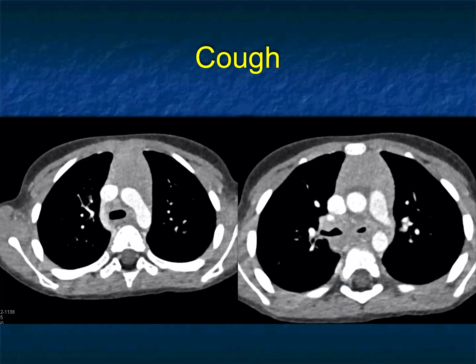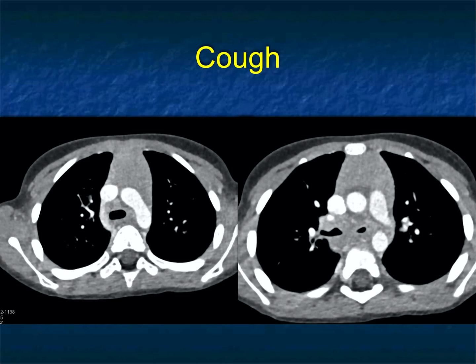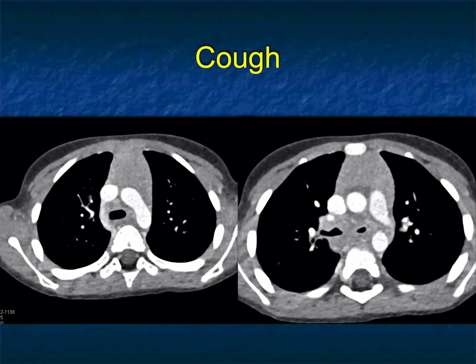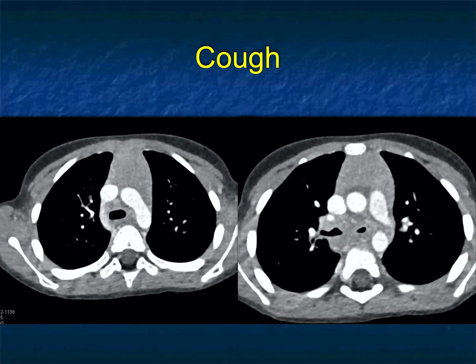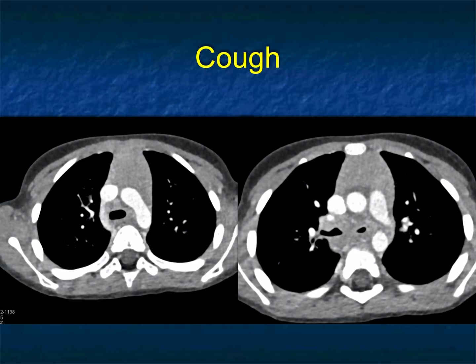This patient presented with a cough — it's a child about 10 years of age. The first thing to recognize is what you're actually seeing. People thought this was lymphoma because there's something in the anterior mediastinum, the posterior mediastinum, and the middle mediastinum. In a patient who's 9 to 15, something smooth and homogeneous in the anterior mediastinum is likely an enlarged thymus, which this indeed is. But look at the airways — they're narrowed. There are nodes, but the nodes have faint calcification. You have to think of lymphoma or malignancy compressing the trachea, but with calcifications present you have to think about inflammatory processes: TB, histoplasmosis, something in that ballpark. Obviously you'll need bronchoscopy and biopsy. Could you still be fooled by lymphoma? To be honest, the answer is unlikely but still a possibility. So what do you think?